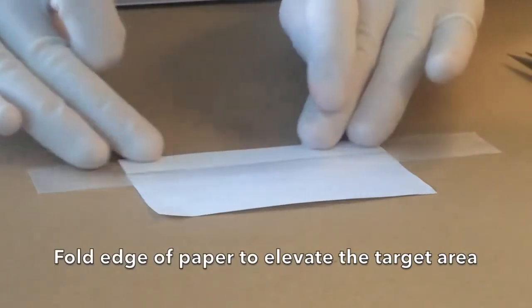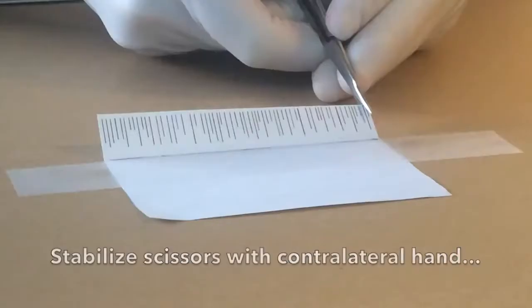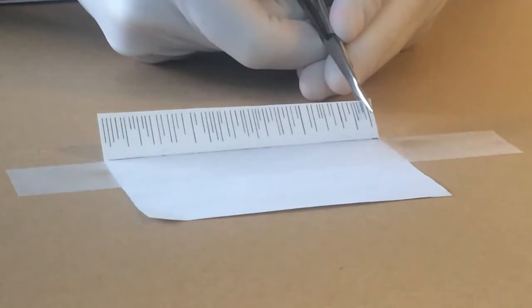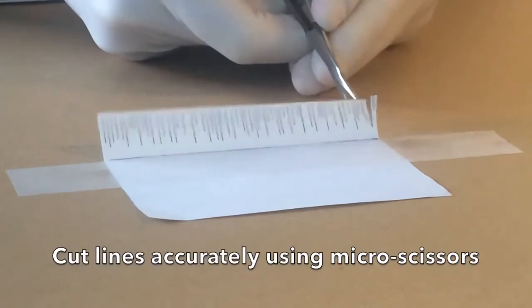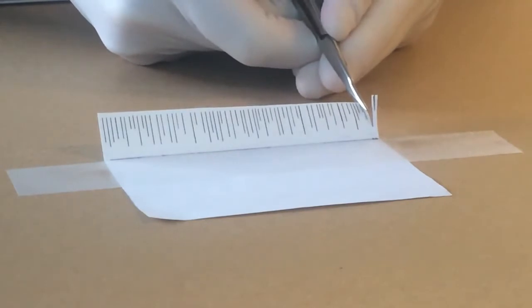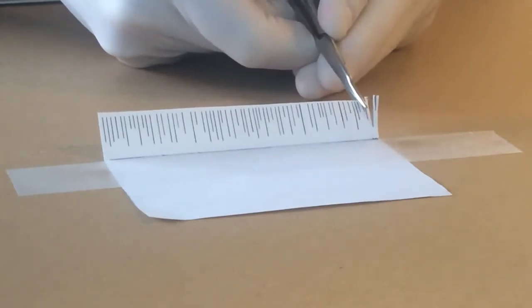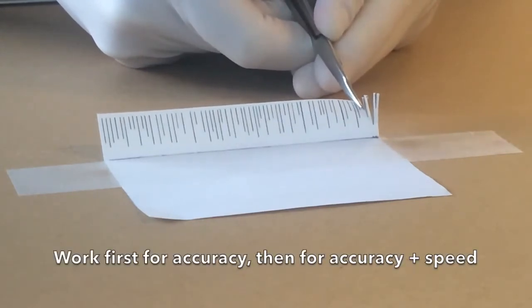The next model is the scissor cut base exercise. First fold the edge of the paper to elevate the target area. Secure the model to the table with tape. It is important to stabilize the scissors with the contralateral hand. The objective is to test the ability to cut the lines accurately using micro scissors. As always, work first for accuracy then accuracy plus speed.